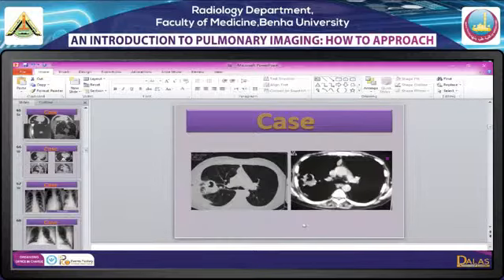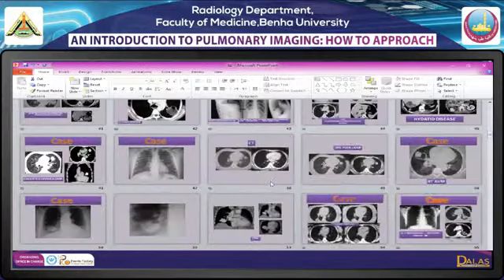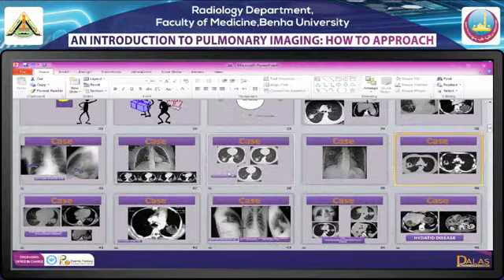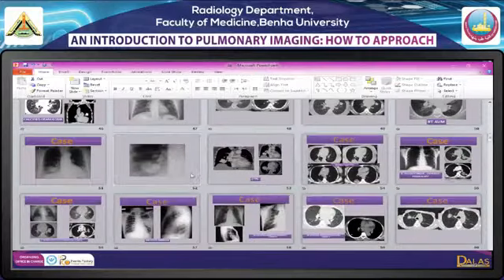طيب ايه السؤال دلوقتي؟ Another question دكتورة يسريه: is there a diagnostic feature for Kaposi sarcoma? اللي انا قلته بالظبط هي الدايجنوستيك فيتشر بتاع الكابوزي. بس اهم حاجه في الكابوزي ان حضرتك تكونسيدر في الدايجنوز من الاول، يعني لازم ابقى في حته انديميك او عيان اميون كومبرومايزد ماركلي عنده ايدز وات ايفر.